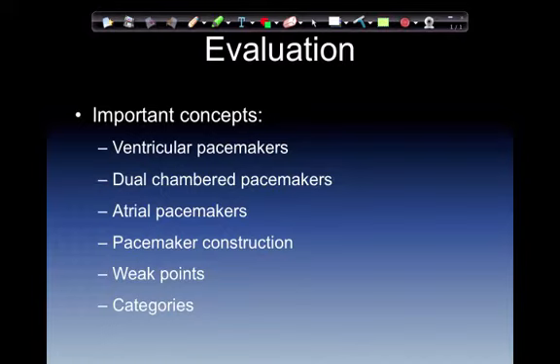Do I have a dual-chambered pacemaker? A dual-chambered pacemaker would be an AV sequential. And are they both capturing? Generally speaking, when they put somebody on an AV sequential it is because they still need their atrial kick for cardiac output. If they have an atrial pacemaker, they could have just had sick sinus syndrome as a youth, or younger, instead of age-related symptoms.